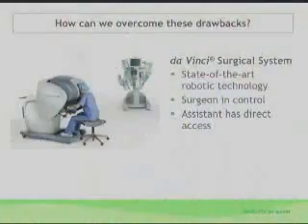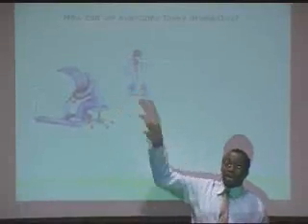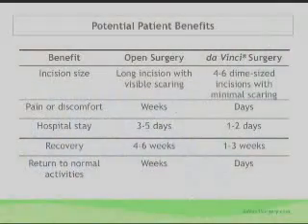It is a 3D system that allows me to visualize and see things at much greater magnification. This is my viewfinder. So the surgeon, which is myself, will sit at this viewfinder. This is the robot that holds on to the instruments. You don't get tired. Robot don't get tired. Normally what we do for our Da Vincis is you have 1, 2, 3, 4 incisions, sometimes 5, depending on how much more dexterity you need. Like I said, most of them are about a dime size, from side to side.